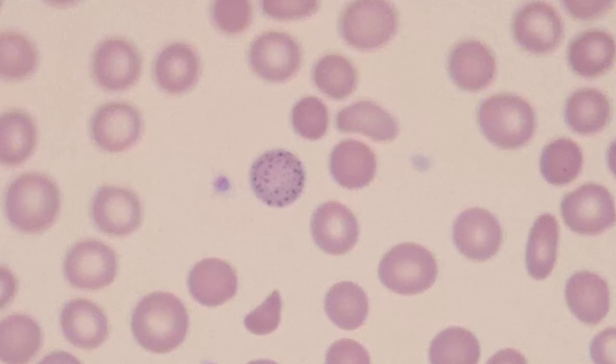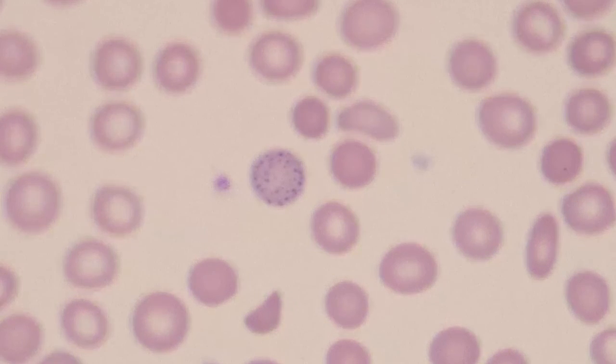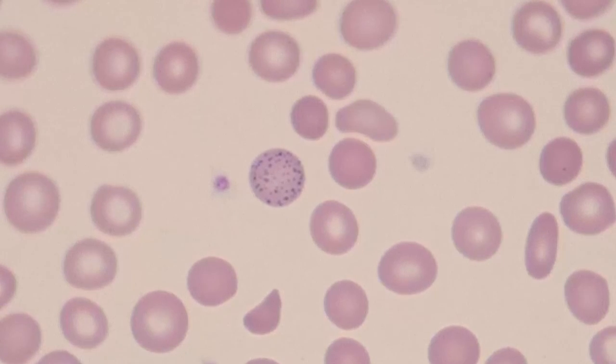And you're going to see basophilic stippling in cases of lead poisoning or heavy metal poisoning. Lead poisoning, probably the most common patient population with that would be children. I think it's a common screen for children who are around or under 1 years old to be screened for lead, because oftentimes in old houses the paint is lead based, and kids stick everything in their mouth. So anyway, this is a great example of basophilic stippling.